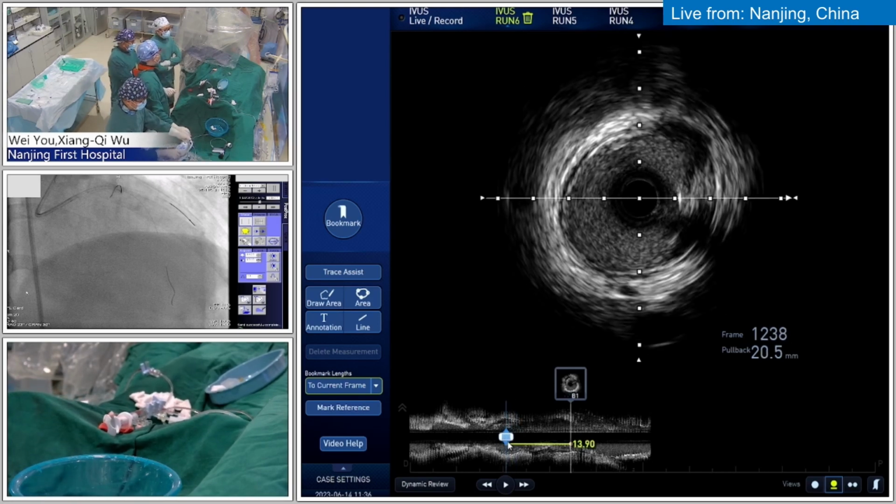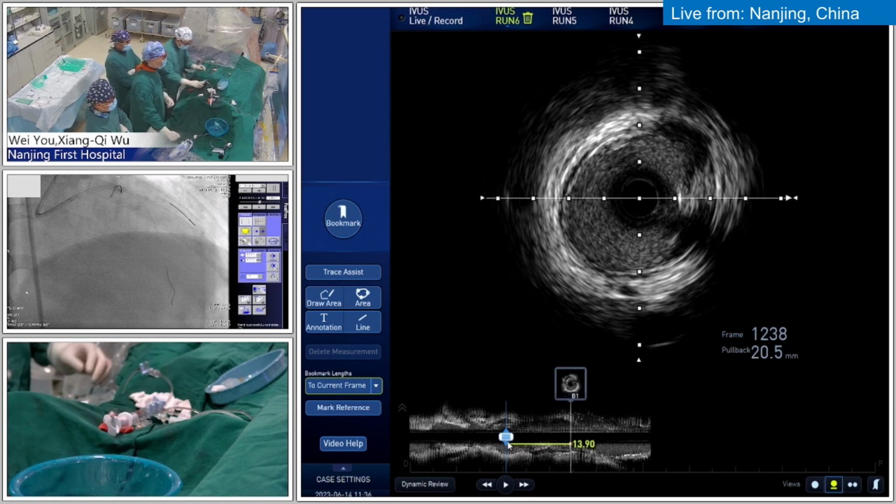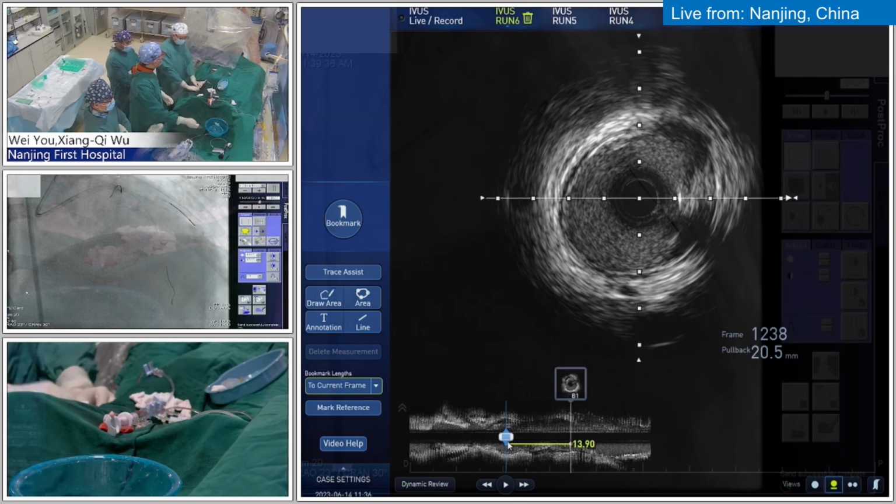This suggests we add one stent for the distal part, just because the edge dissection involves the media. Yes, absolutely. Although the length is less than that, probably you're looking at a 3.0, no? Sure, 3.0. Length. Beautiful. Okay, sounds good.